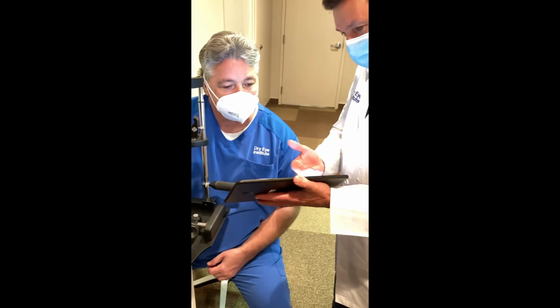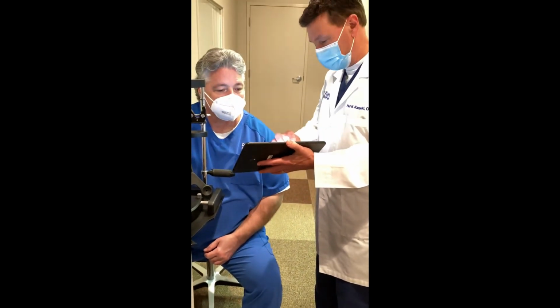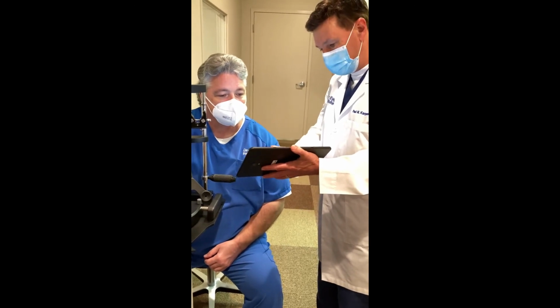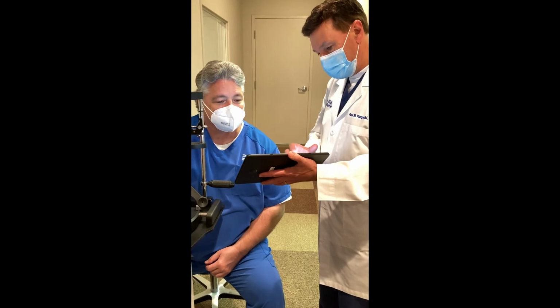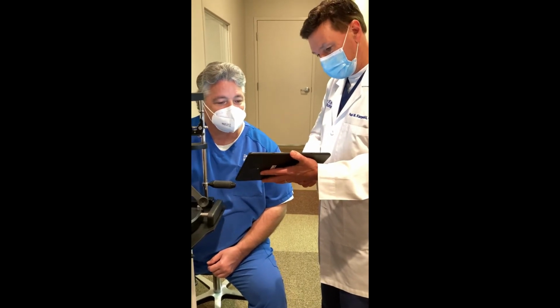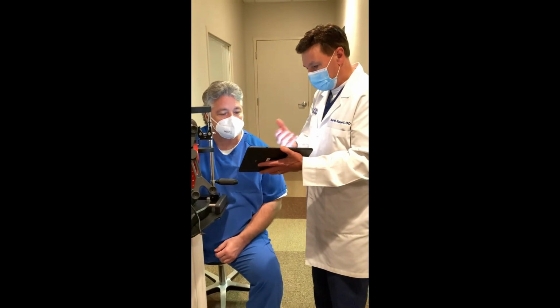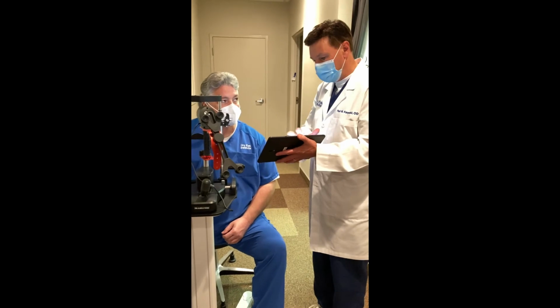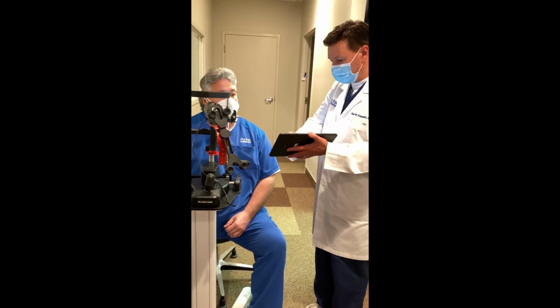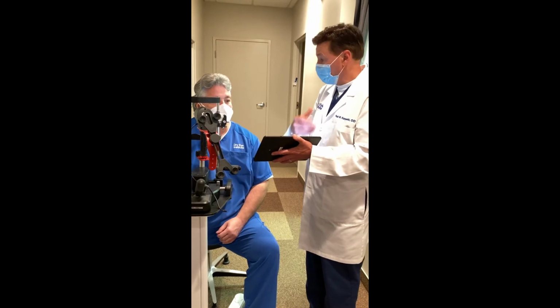In actuality, what we're seeing, and these are very healthy meibomian glands. You see there's an entire array of glands. That's a really good sign. These little dark areas, though, tell me that there's likely some stress on these glands. So this would be a good case where we would want to take perhaps some preventative measures to ensure your meibomian glands continue to function. And many times we see symptoms present before the signs. And keep in mind that even though you have an entire array of meibomian glands, and it's so important to know what they look like, their function is also key.